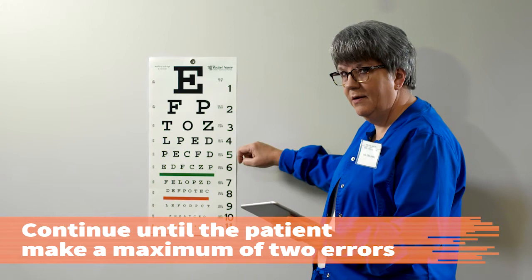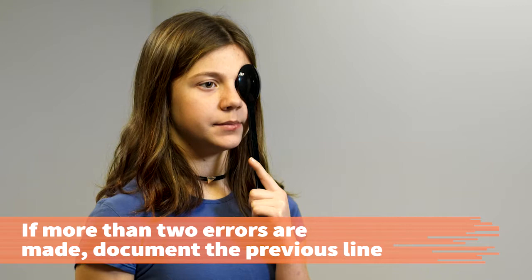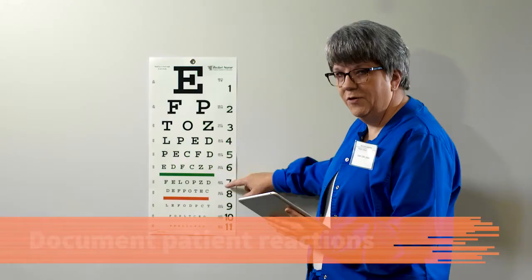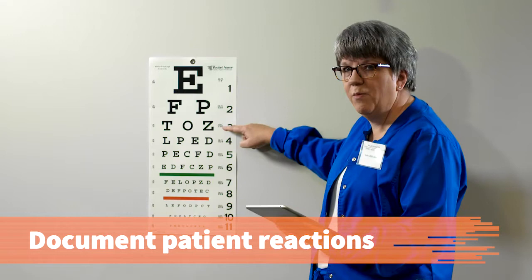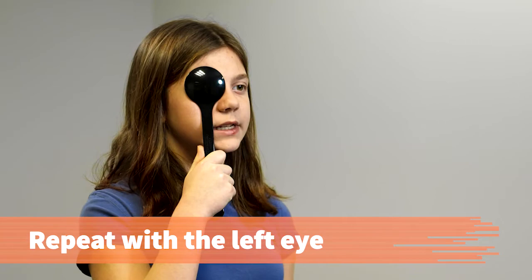Proceed down the rows of the chart until the smallest row the patient can read with a maximum of two errors is reached. If one or two letters are missed, the outcome is documented with a minus sign and the number of errors. If more than two errors are made, the previous line should be documented. Document any of the patient's reactions such as squinting, leaning, tearing up, or blinking while reading the chart, as they indicate the patient may be having difficulty with the test.